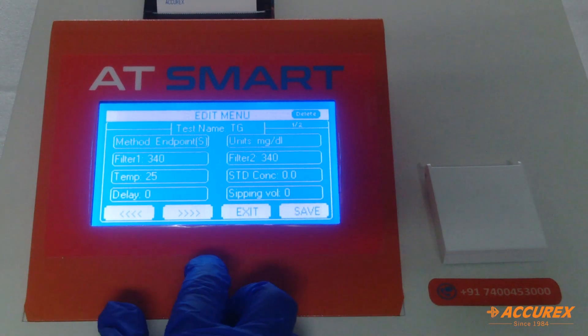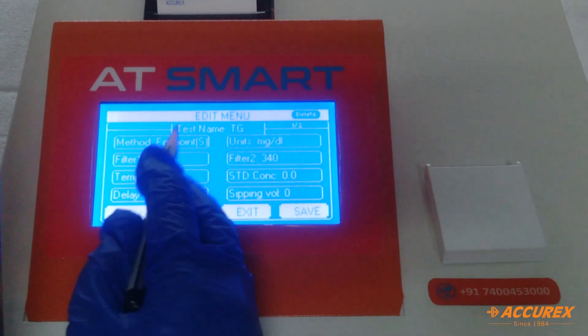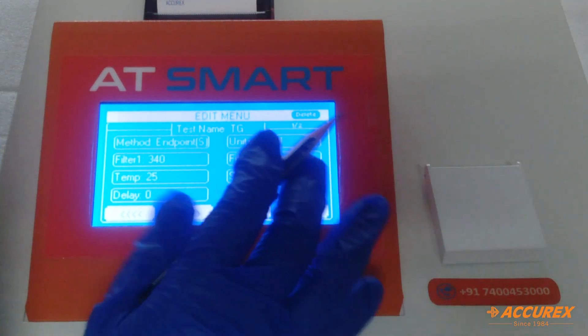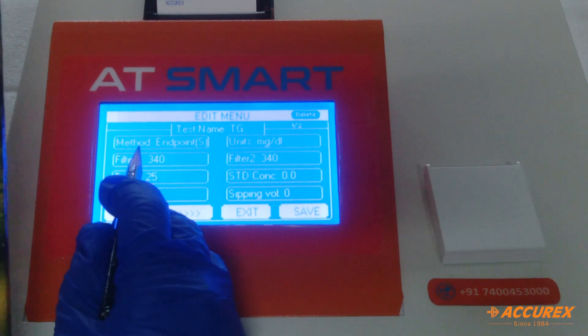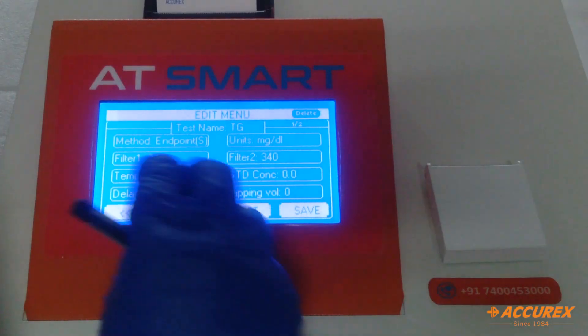For the remaining parameters, we are referring to the pack insert. The first parameter is method. TG's reaction type is endpoint, so select endpoint and save.